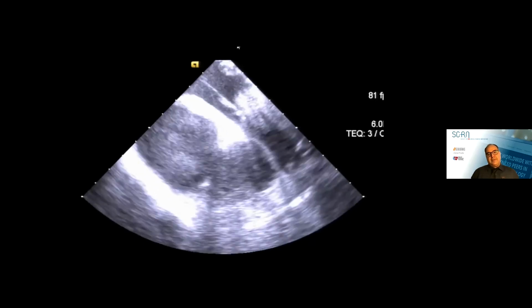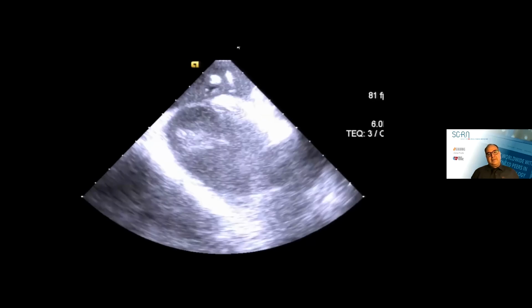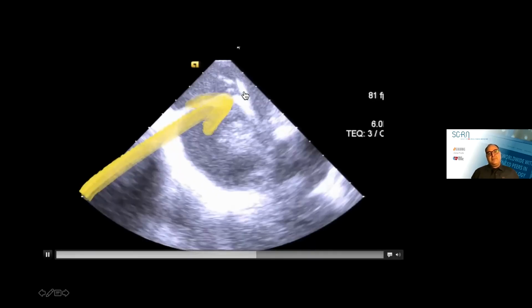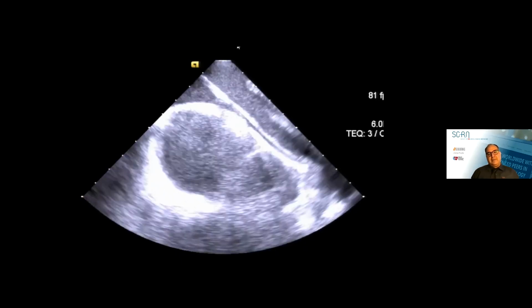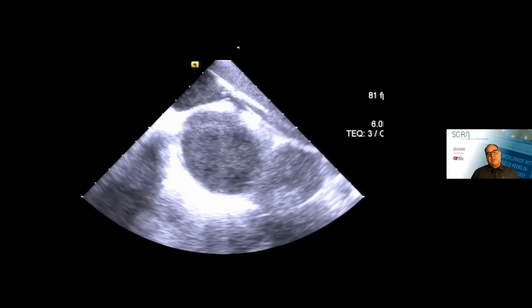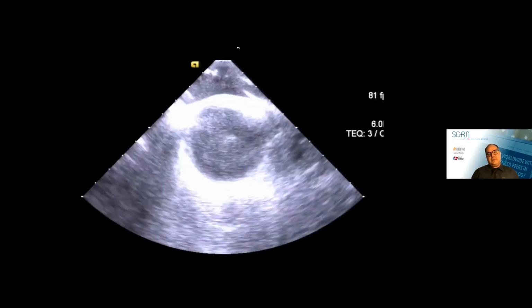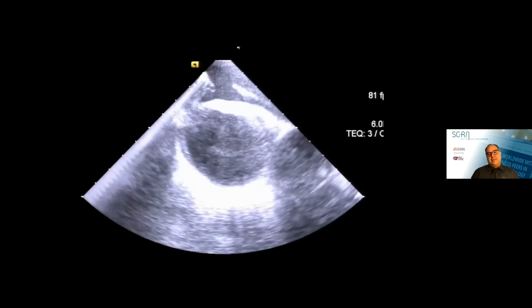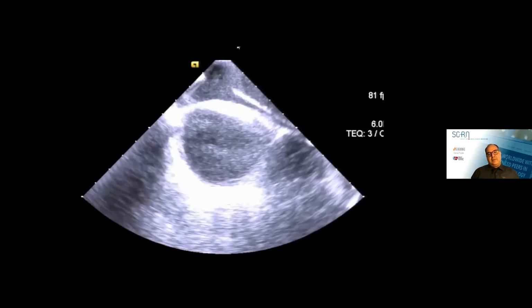So we put the needle, the catheter's coming down, and right about there, it wants to tangle with the right atrial lead. And again, before dropping the catheter into the right atrium, we'll untangle it there by a clockwise rotation. And you can actually follow it very closely. And it's released right there.